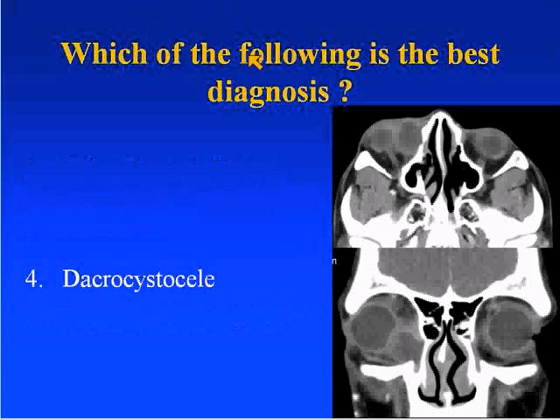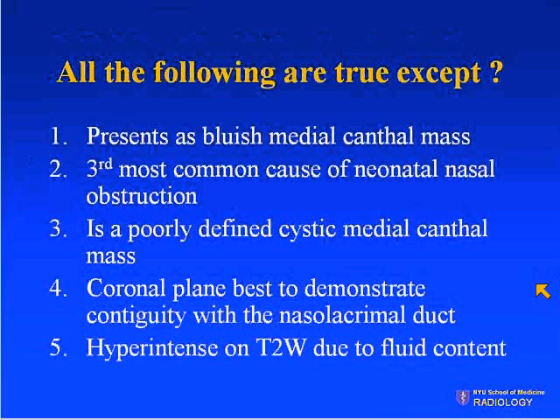If you look at the axial image, we can see this cystic lesion right along the medial canthal region. What's really key is this coronal image. All of the following are true except: number one, presents as bluish medial canthal mass; number two, third most common cause of neonatal nasal obstruction; number three, a poorly defined cystic medial canthal mass; number four, coronal plane best to demonstrate contiguity with the nasal lacrimal duct; and number five, hyperintense on T2-weighted images due to fluid content.